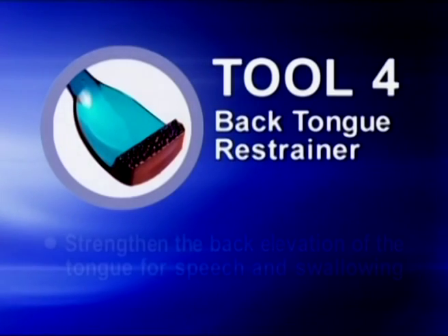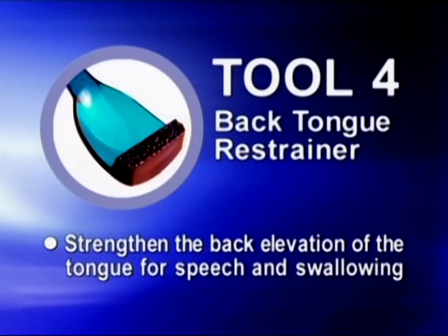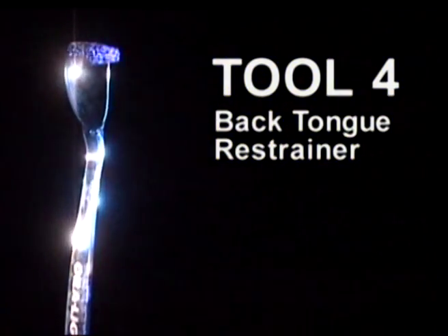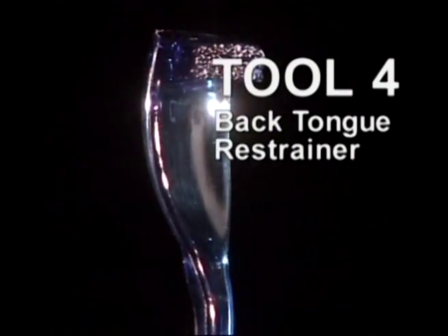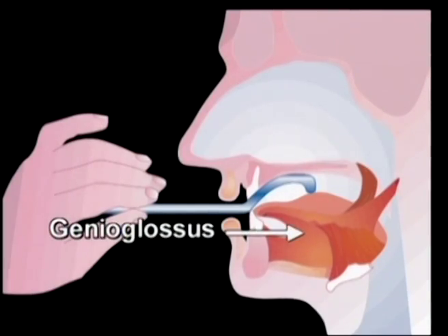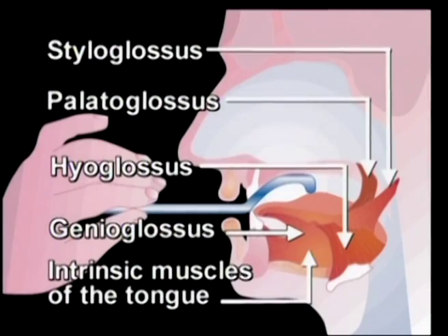Tool number 4 is designed to strengthen the back elevation of the tongue for speech and swallowing. Weak tongue elevation movement that cannot contact the back of the palate during swallowing may lead to aspiration of food into the lungs and possible pneumonia. Tool number 4 has an elevated ridge with a textured surface. The combination of these features helps the tongue feel the proper placement in the back of the palate. Muscles exercised include genioglossus, styloglossus, palatoglossus, hyoglossus, and intrinsic muscles of the tongue.